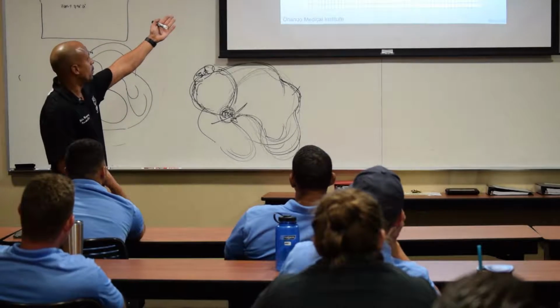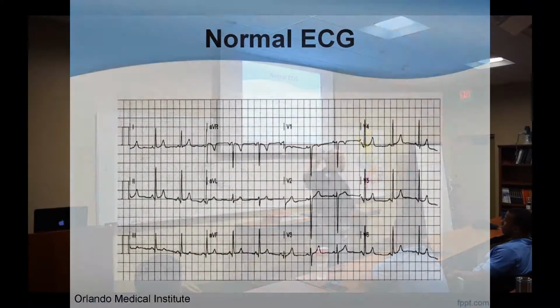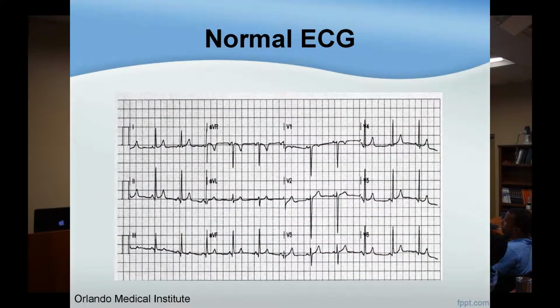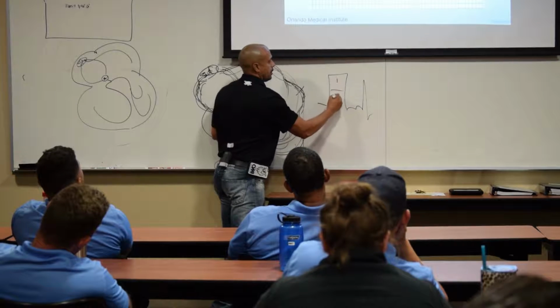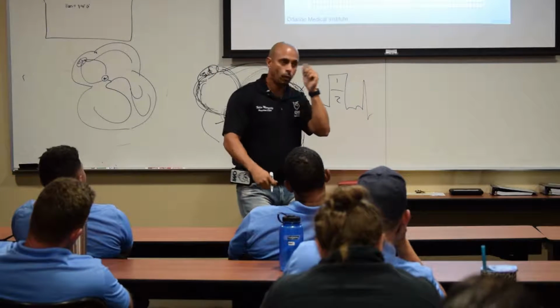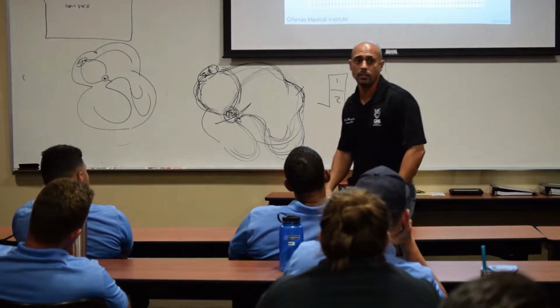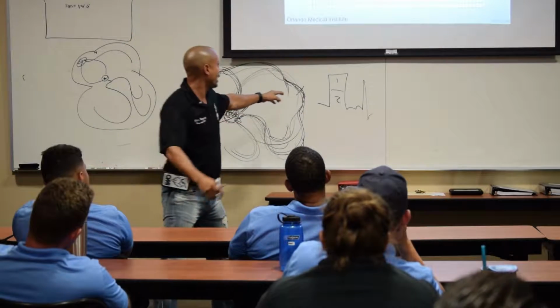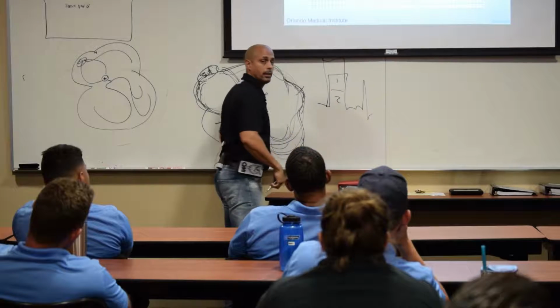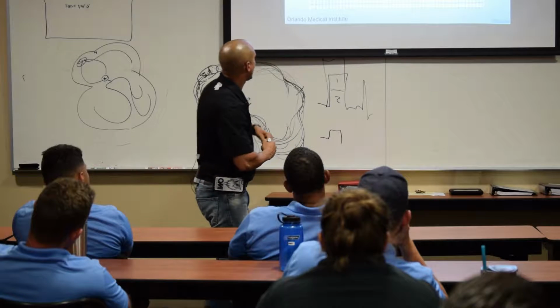But what it was is, in lead 1, the P wave was upside down and aVR was upright. Okay? So I always check that because leads have to be on correctly. Make sure of my calibration. If you look at a 12 lead, it always starts with this calibration. This right here is for a reason. 2 big boxes tells me it's 1 millivolt, properly calibrated. If it's higher than that, you might mistake this for LVH, left ventricular hypertrophy, because it'll give you a real peaked R wave. Meanwhile, your calibration is just super high. Same thing. If it's just 1 box, it's too low. So check your calibration.